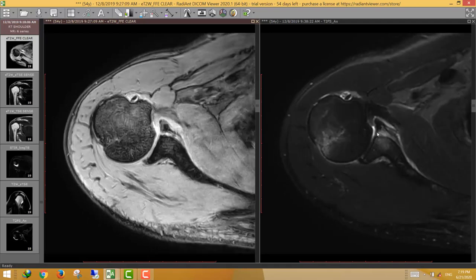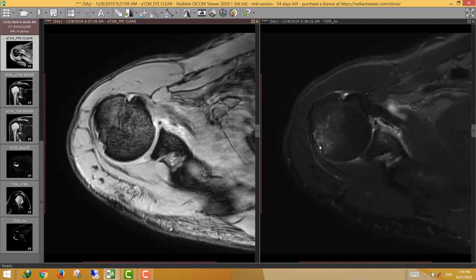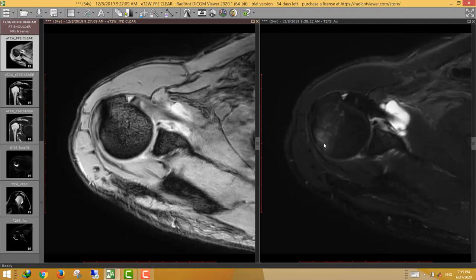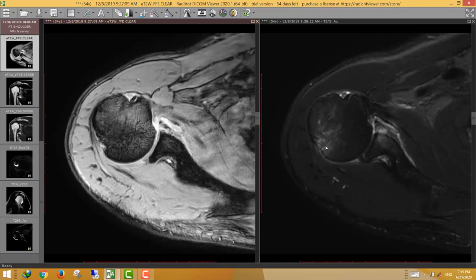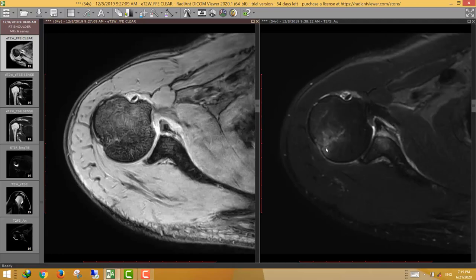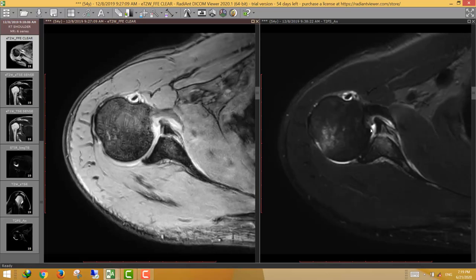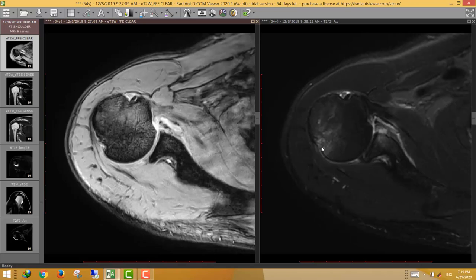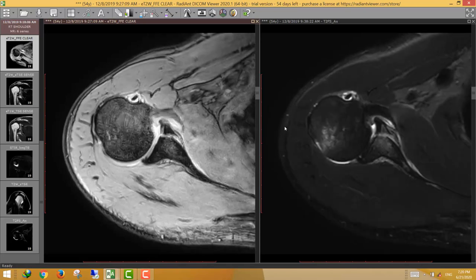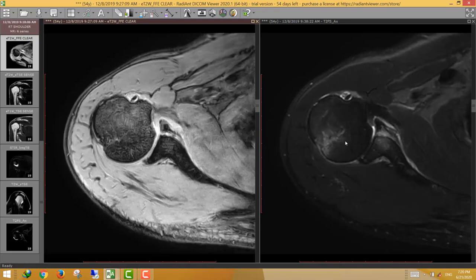We can also see marrow contusion at the posterolateral aspect of the humeral head — an impaction injury, or Hill-Sachs injury. So the patient has an osseous Bankart with significant glenoid bone loss and a large separated bone fragment, plus a posterolateral humeral head marrow contusion — a Hill-Sachs injury.